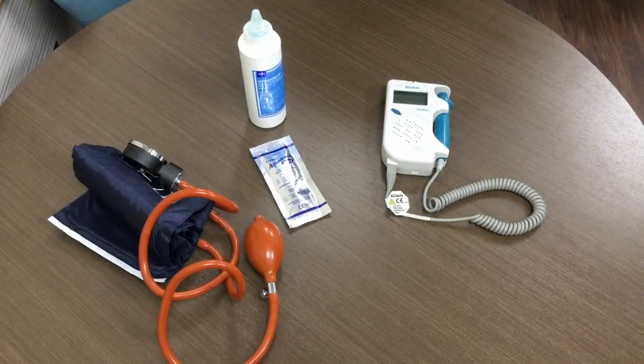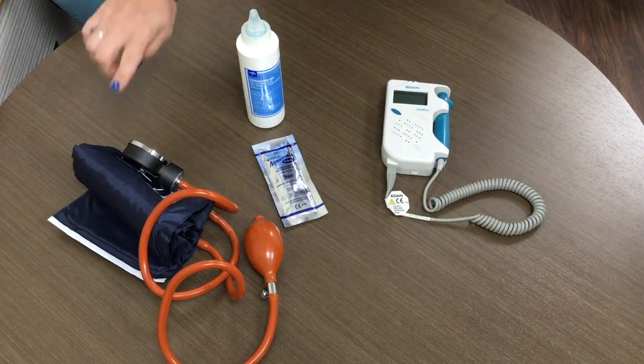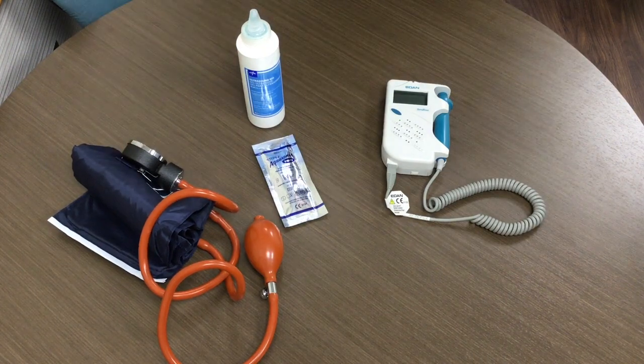The first step is to gather the equipment you will need. You will need conduction gel, a manual blood pressure cuff, and a Doppler device.